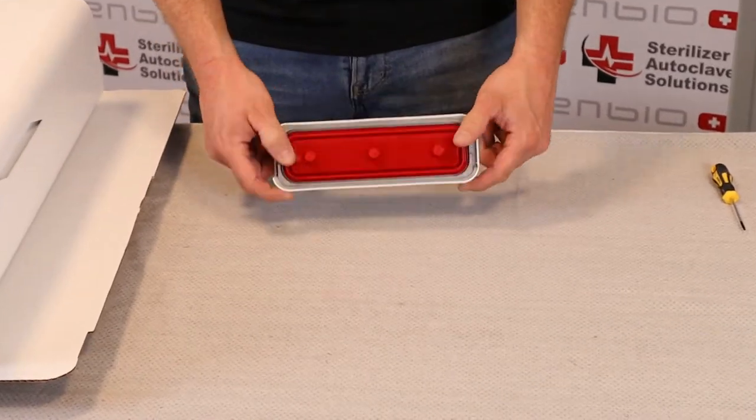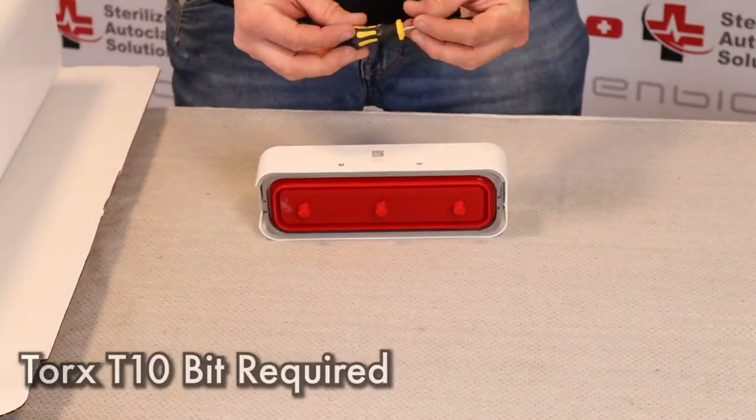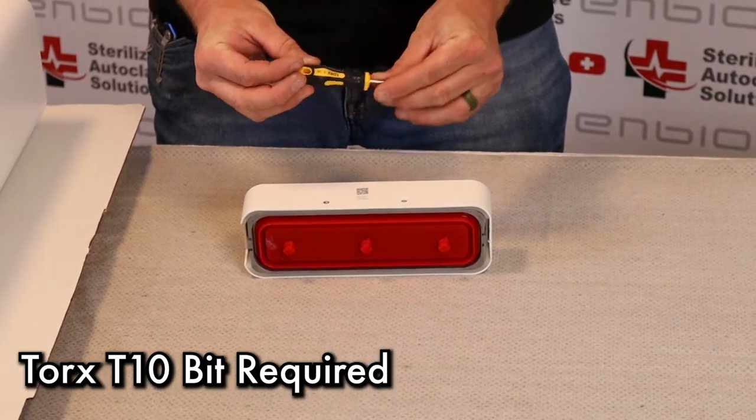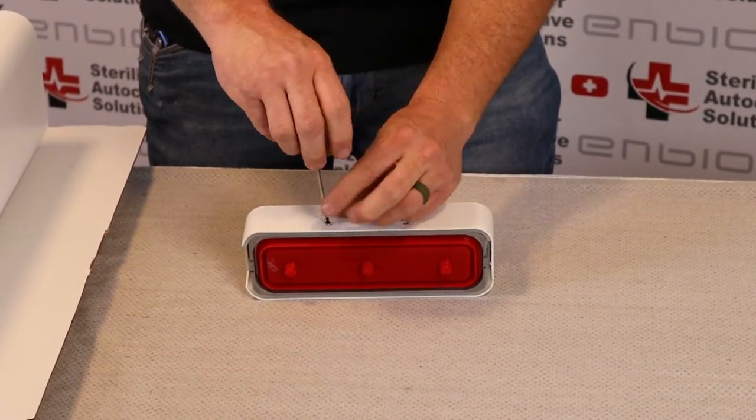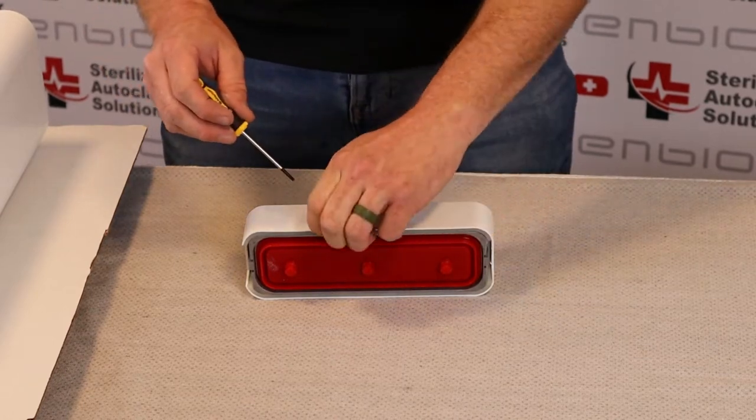First thing we're going to do is flip the door upside down. Using a Torx T10, there are two screws that hold this in. We'll be removing both screws.